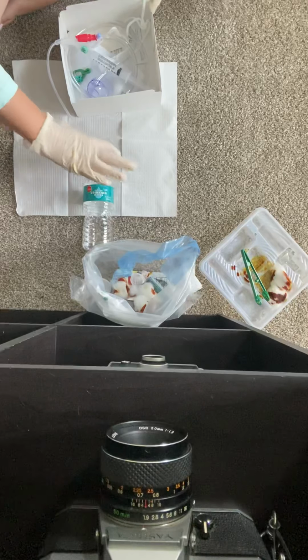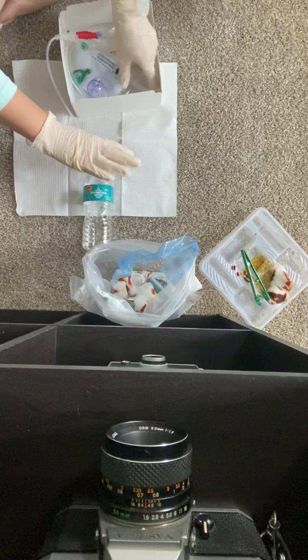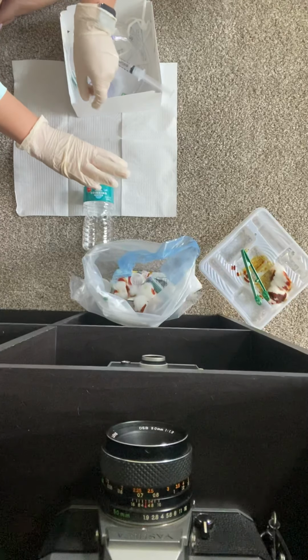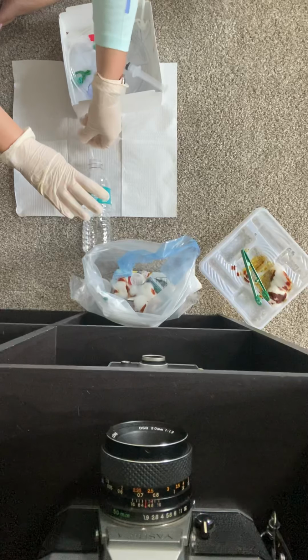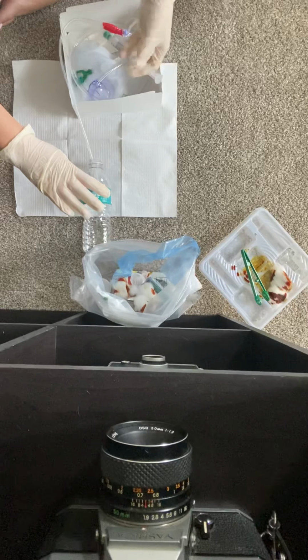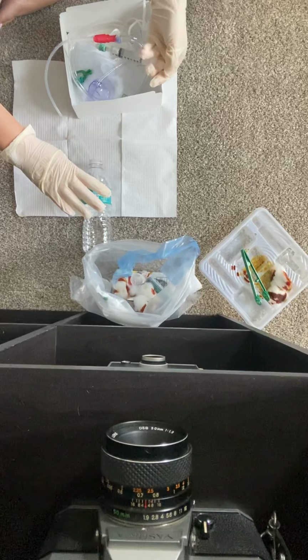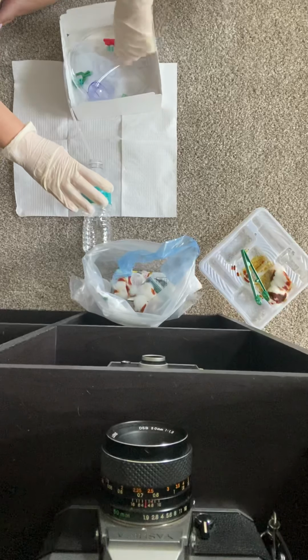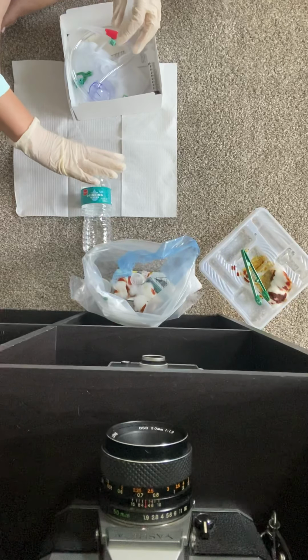Okay, so let's say I already saw my flash of urine. So what I'm going to do is advance it about 1 to 2 inches. So let's say I advance a little more. Sorry, this is really hard in a water bottle. Okay, so I advanced and then I'm going to blow up my balloon. Okay, so my balloon is inflated.